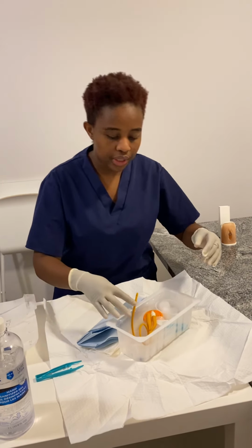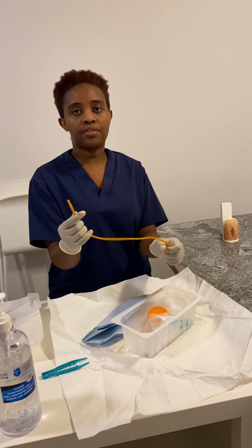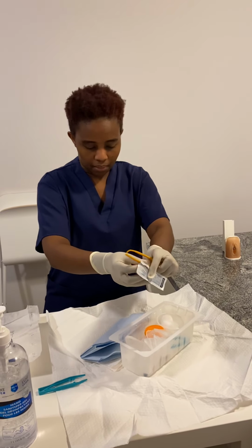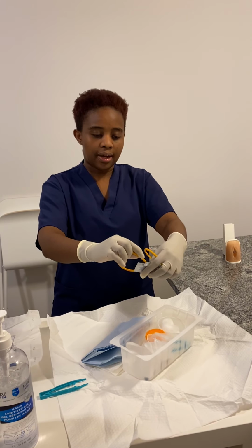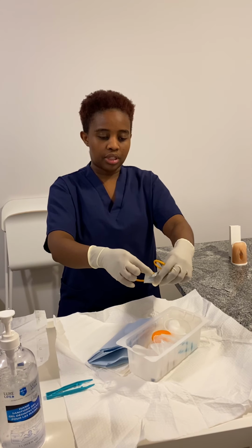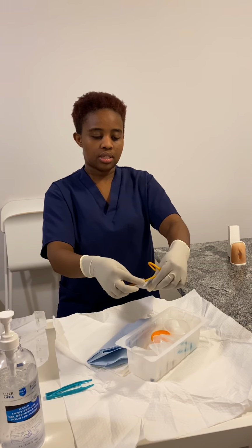And then I'm going to lubricate my catheter. Since I'm going to insert a female catheter, I have to lubricate the catheter 2.5 to 5 centimeters. And I have to make sure that I'm not contaminating any sterile equipment.